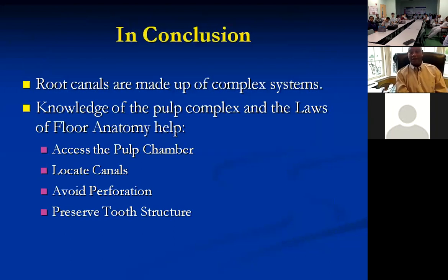You want to access that chamber, locate those canals, try to avoid perforation, always have a good sense of where you are. And if you're not sure, if you're trying to find those canals and going in with the burr, it always helps to go back and take an x-ray and see where you are. You could put something in the canal to get a landmark, just to see where you are, and then go back. And of course, if you know your root canal anatomy and you know what you're looking for when you go in, it's going to help preserve tooth structure. So you're not gouging out the inside of the tooth looking for canals. You have a sense of where they are.